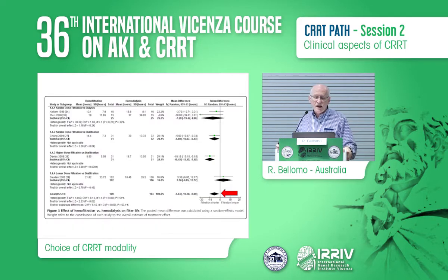And this is one of them, and it was able to look at a variety of outcomes. And this is an assessment of the effect of hemofiltration versus hemodialysis, CVVH versus CVVHD, on mortality. And you can see there is no significant signal there. But it is of interest that when they were able to compare the effect of hemofiltration versus hemodialysis, there was a signal in favor of a shorter filter life, against, if you wish, CVVH, with convective therapy versus diffusive therapy.